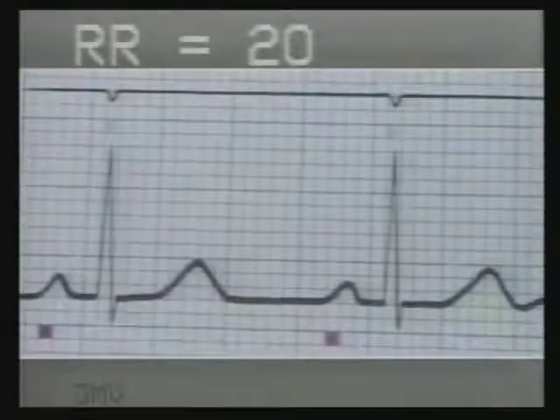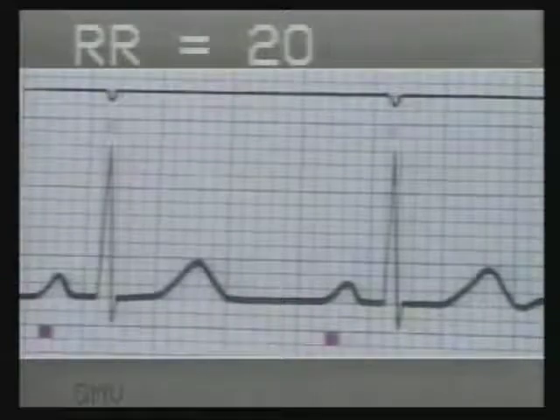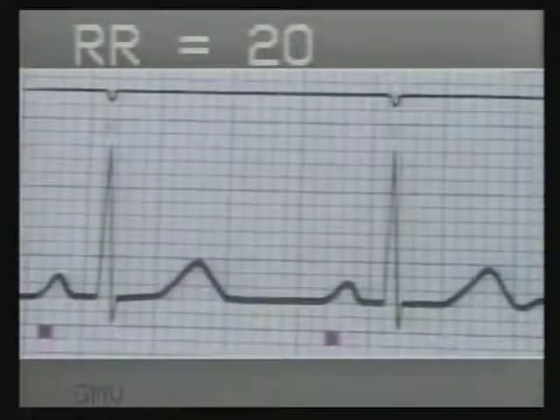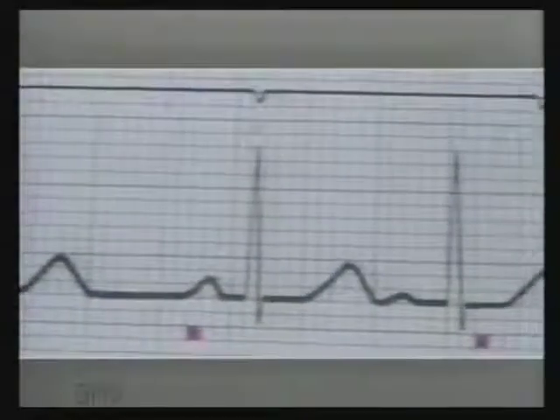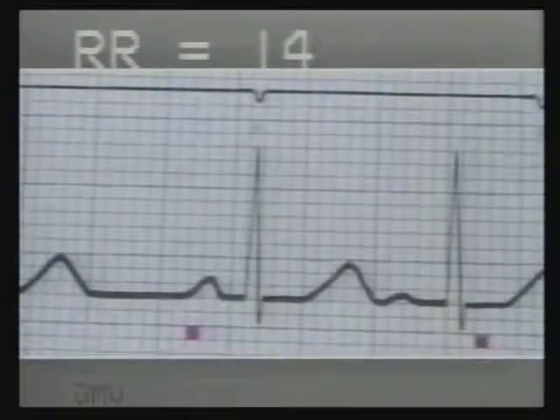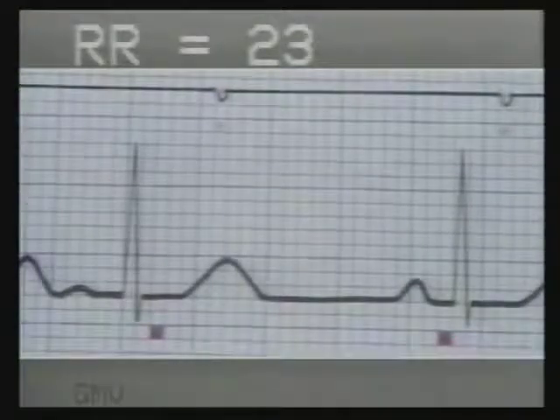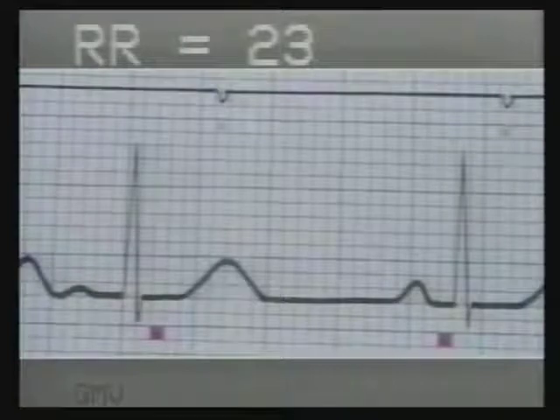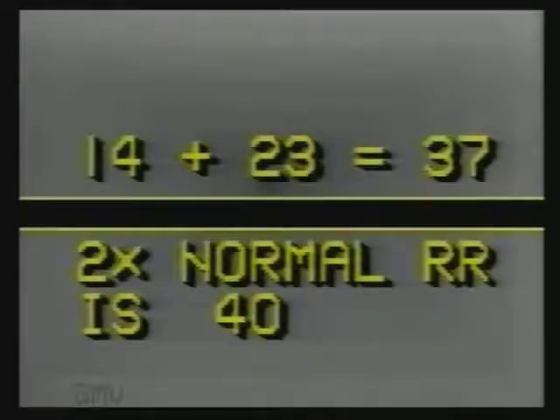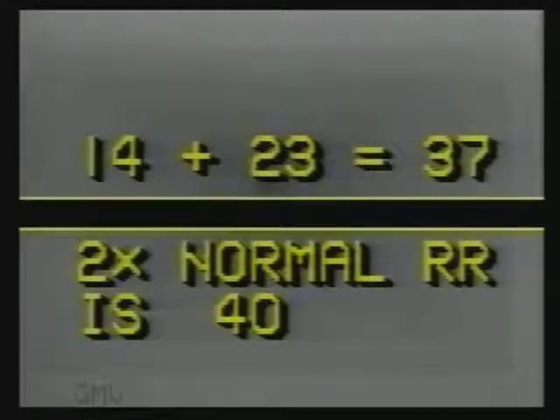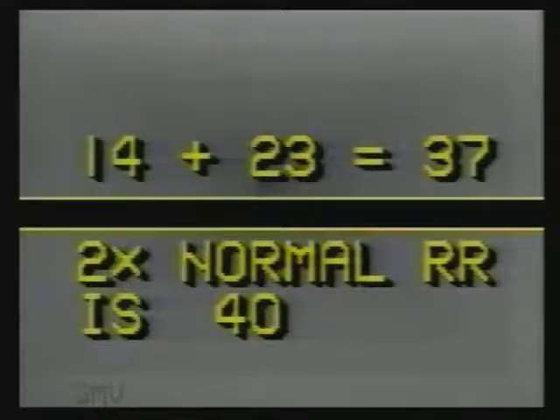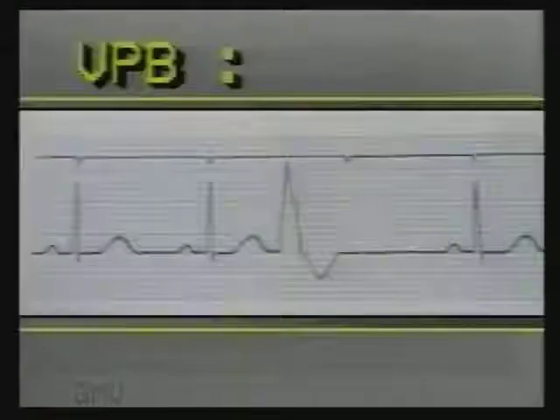To study the compensatory pause, count each RR interval. The first normal RR interval is 20 small squares. The RR interval of the premature beat is 14 small squares, and the RR interval of the compensatory pause is 23 small squares. The two added together — 14 plus 23 — is 37 small squares. Whereas it should have been exactly two times the normal RR interval of 20 small squares, that is 40 small squares. So this is an incomplete compensatory pause.